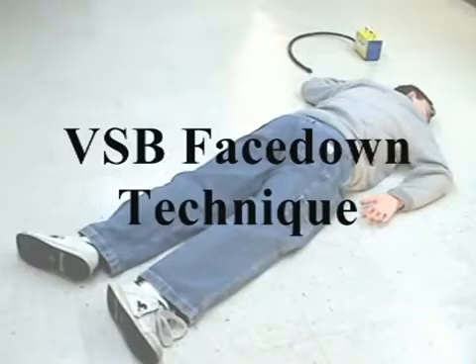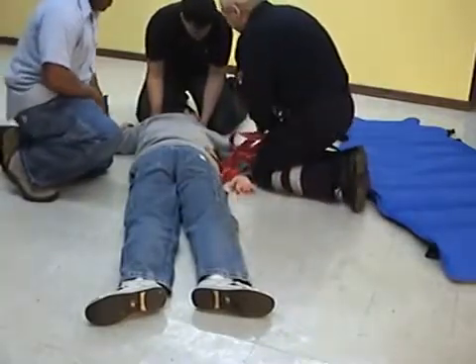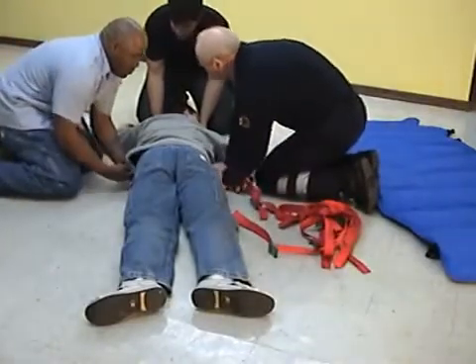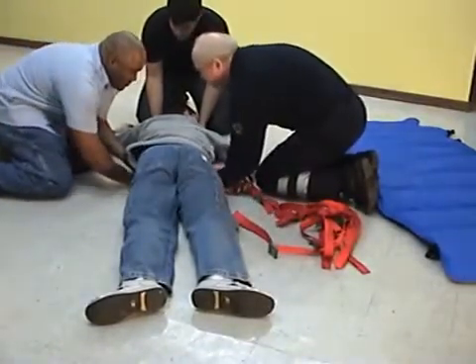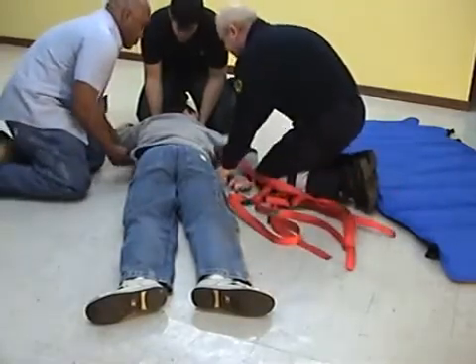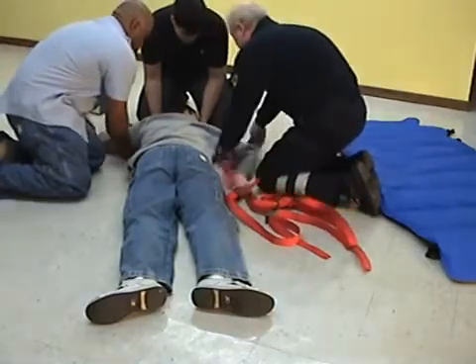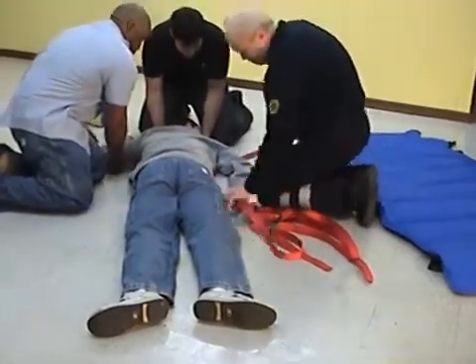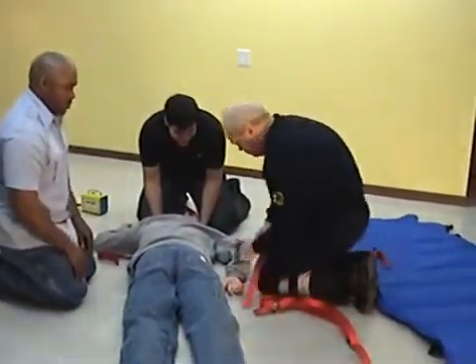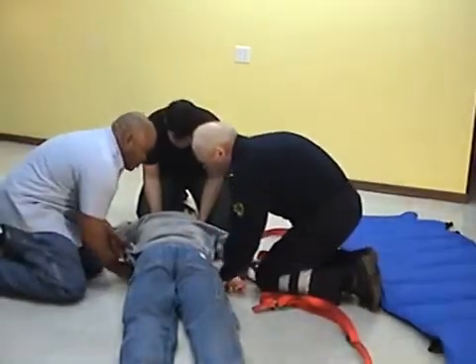When rescuing a face down patient, three to four rescue personnel are ideal. Using the face down strap system makes it easier to strap the patient in a face down situation. The goal is to get the patient face up to facilitate care and transportation with an absolute minimum of patient movement. Slide the face down straps under the shoulder, one under the waist and one under the legs. One of the two buckles should be under the patient.